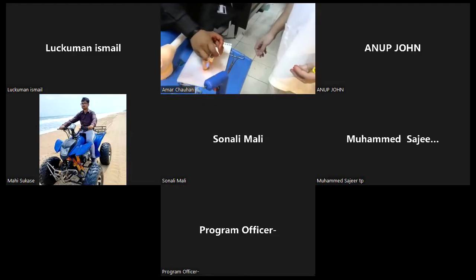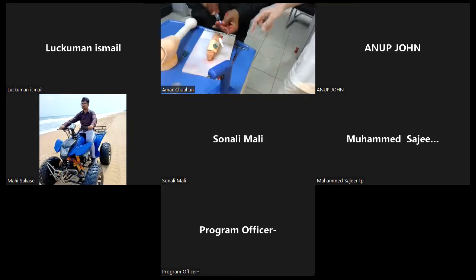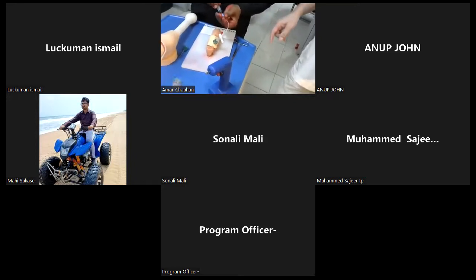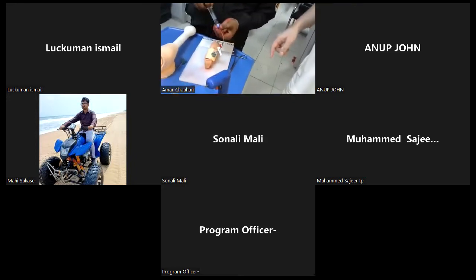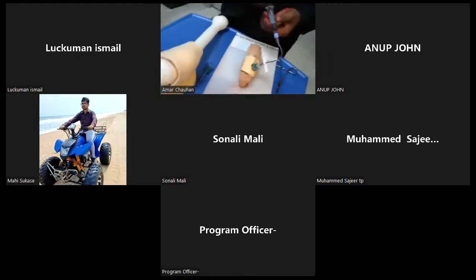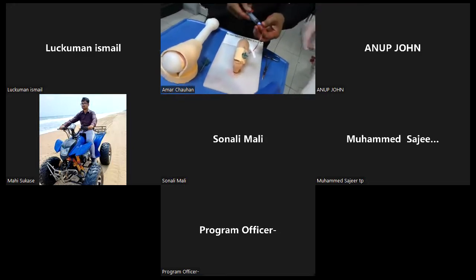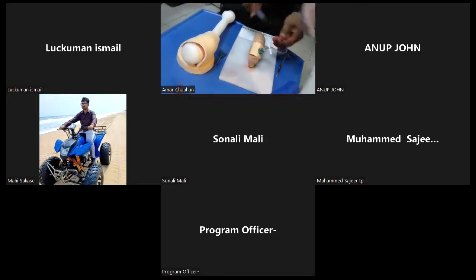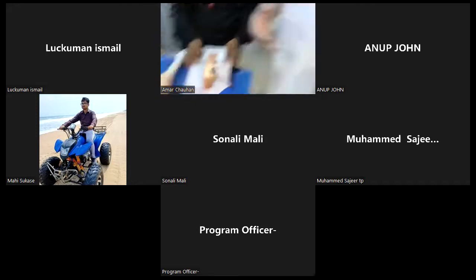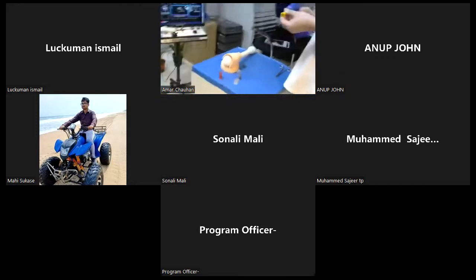One more thing, what about the refilling of the inks, that kind of thing? You have to aspirate slowly. So this connector and this fixer will be separate from the mannequin, but not very costly. It is very cheap. That is our idea. We want to make a very low cost mannequin. Okay, that is fine.